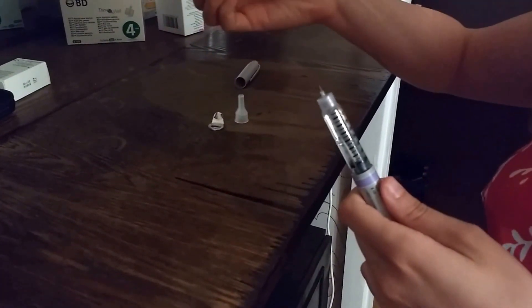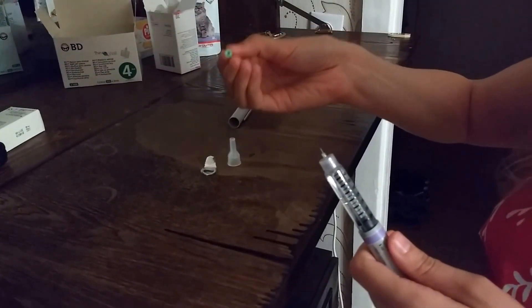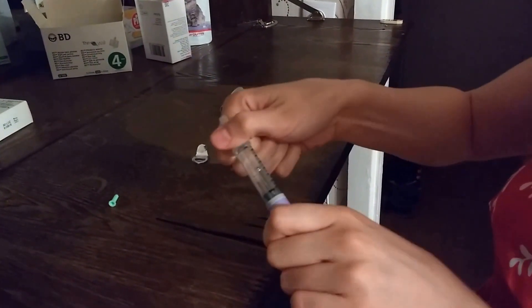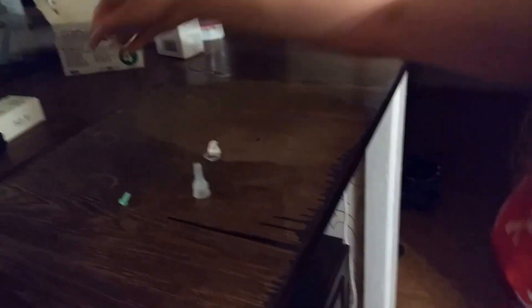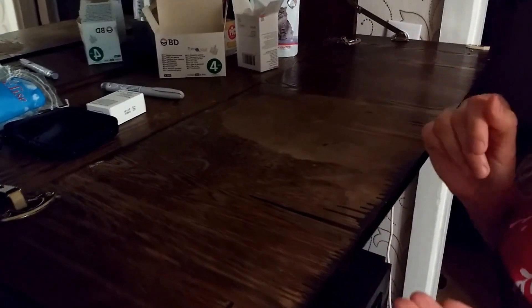After you are done, don't put the green cap on — I have done it and poked myself, and it's not nice. Just put the big one on and put the lid on. Put it back in your cupboard and you can throw the needle bits away.